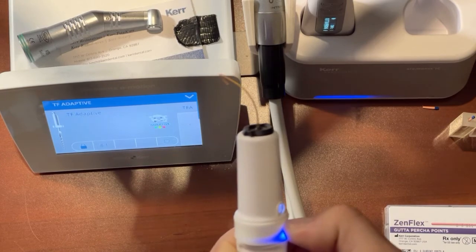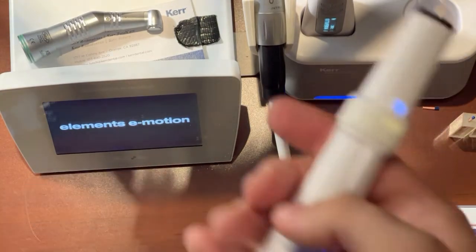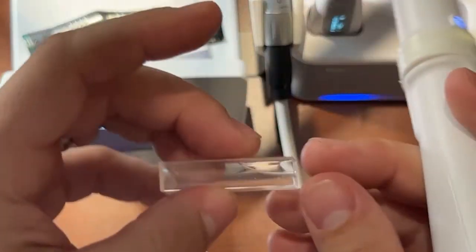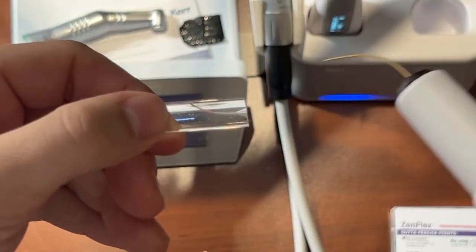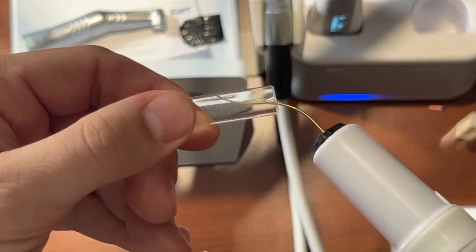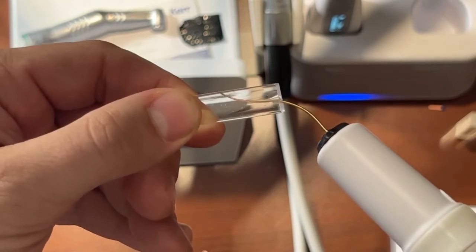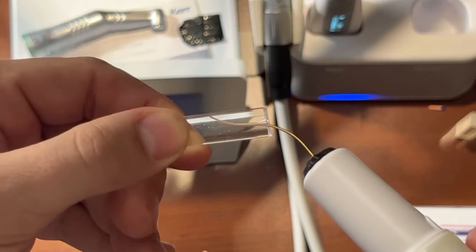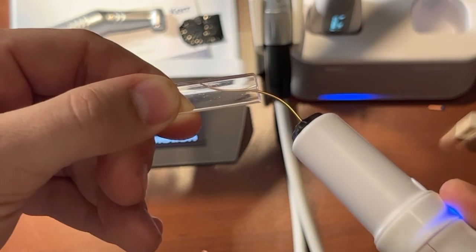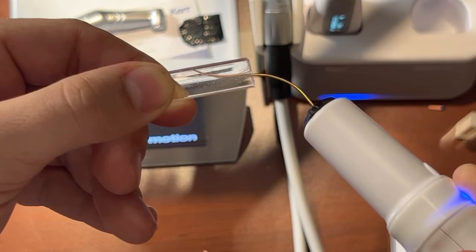We're going to hold this until we start to see some gutta percha come out. So now you can kind of see some gutta percha starting to extrude. Perfect. Then we're going to come into this canal that we already created the plug with. We're going to just hold that there for about 5 to 10 seconds. The tip is hot, so it's going to begin to melt that middle third of the canal. Then we're going to hold the heat ring, and as we hold the heat ring, it's going to start to backfill us out of the canal.